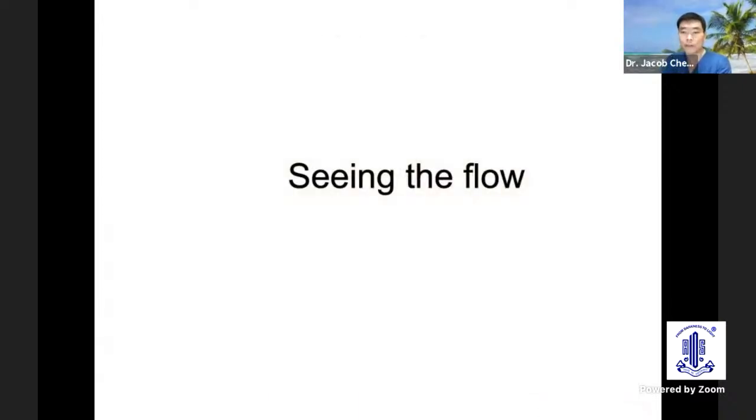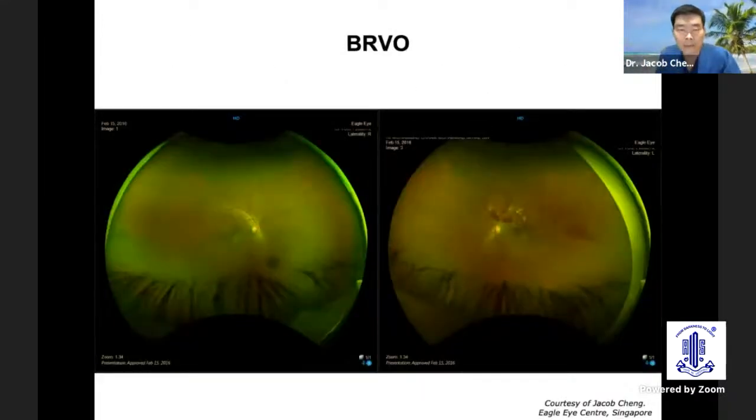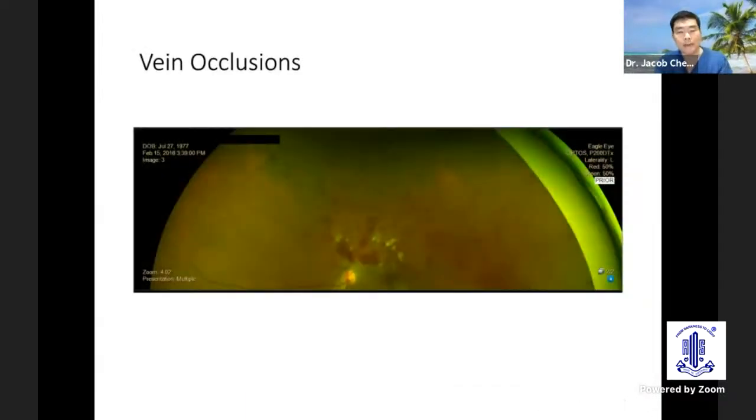How about seeing the flow finally? We do know that it's tedious and laborious for the technician to image the peripheral capillary retina, especially in retinal vein occlusion, to capture not just the central macular edema or ischemia, but also the peripheral fallout and peripheral ischemia. Here, you can see the symptomatic left eye of this patient, but the right eye is normal. Here is a magnified view of the branch retinal vein occlusion.